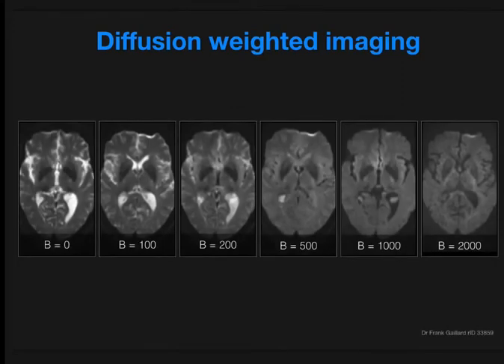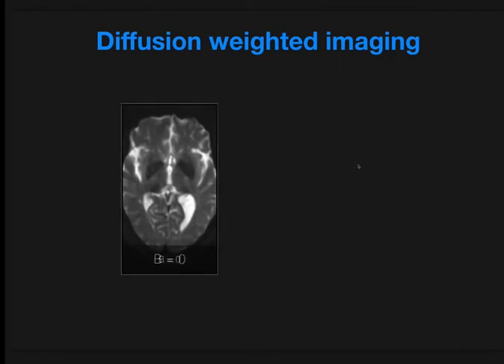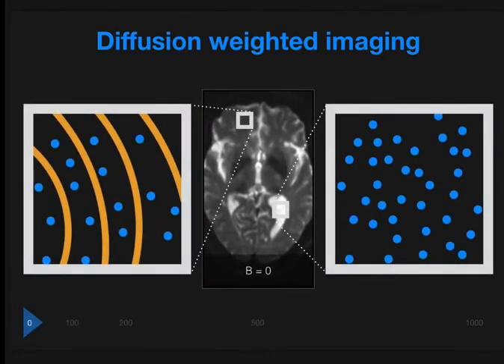A normal brain was scanned at multiple B values, ranging from B0 to B2000. Most centers perform B1000 in the brain, and this is the DWI image we're mostly familiar with. There is a smooth gradation across signal intensity. Concentrating on CSF, it remains bright until about a B value of 500, at which point it's isointense, and then becomes progressively darker. In contrast, white matter remains essentially the same signal intensity regardless of B value.